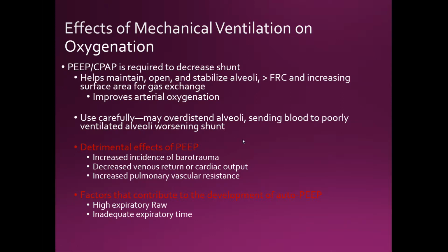So, detrimental effects of PEEP. It can increase the incidence of barotrauma. Again, we can accidentally over-distend with the PEEP, causing some barotrauma. We can decrease venous return or cardiac output.